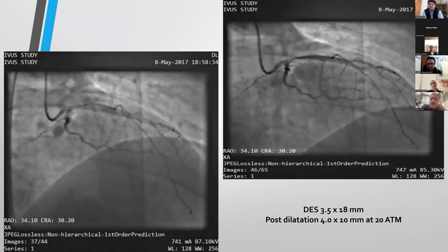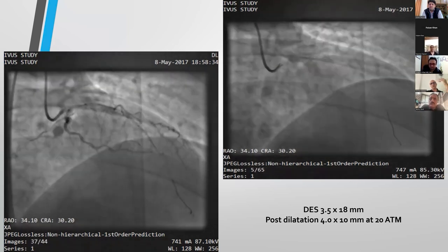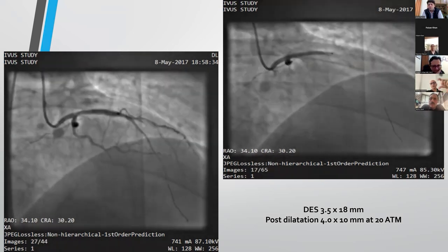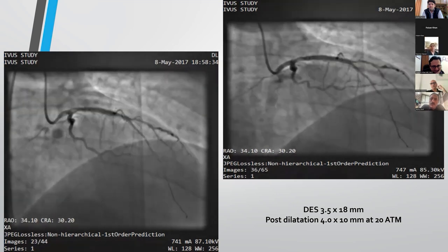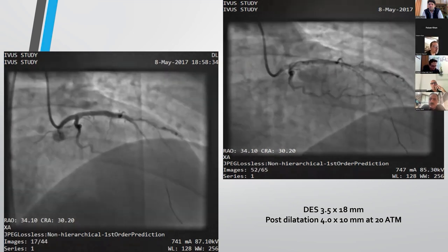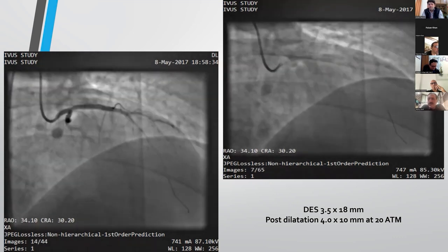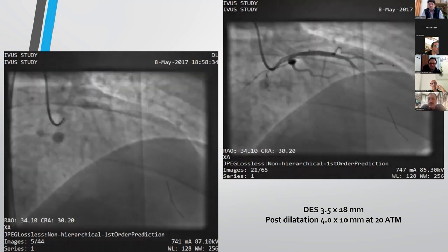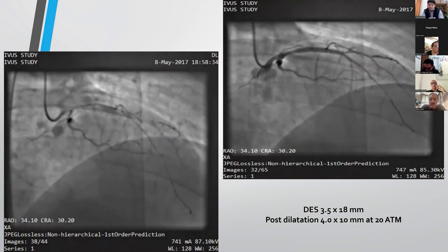Absolutely. But it's a great case to demonstrate how visually your stent sizing can be so undersized, because visually they thought maybe 2.5 would be enough. And you will now talk about how to size on IVUS. That's another problem, Usman, when a vessel is diffusely diseased and you end up undersizing so much. I've seen this so often: the vessel is diffusely diseased distally, you start comparing with the distal vessel, and then you end up putting in such small stents. And we know that the LAD is unlikely to be less than 3, so you don't want to put in such small sizes.